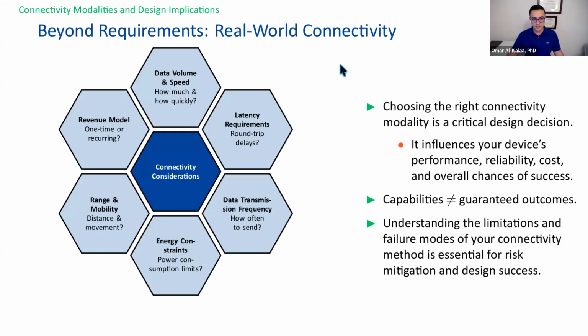You should start by asking questions like, how much data do I have? How quickly do I want to transmit that data? How much latency can I tolerate? The use case that my medical device is implementing, how latency tolerant is it? How often do I need to send? Am I sending a packet every hour, or am I streaming video that forces me to transmit at much higher frequency?